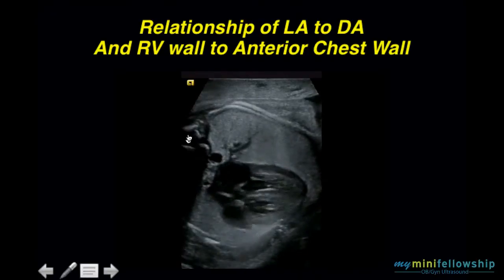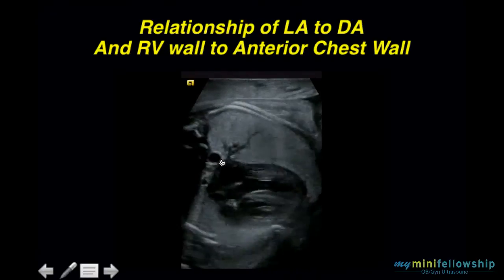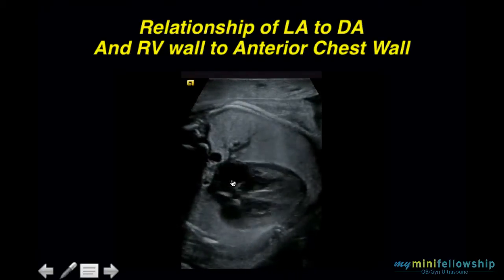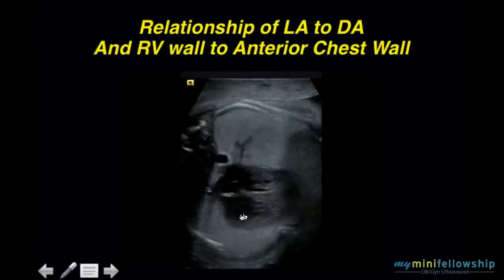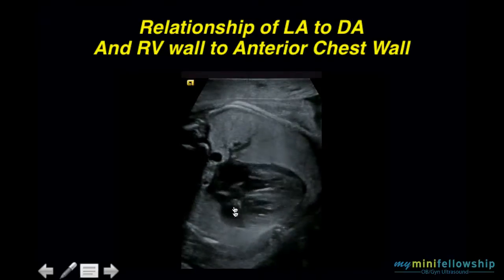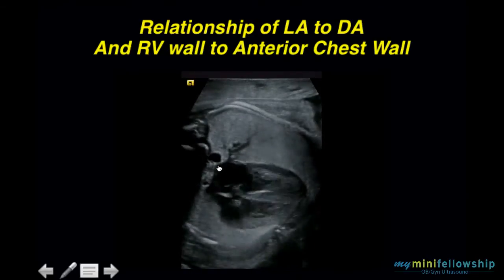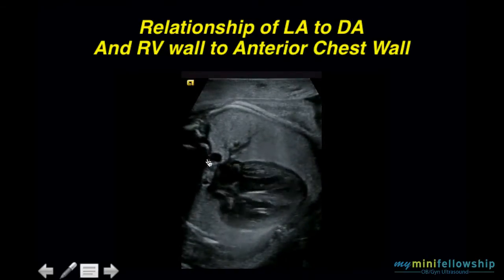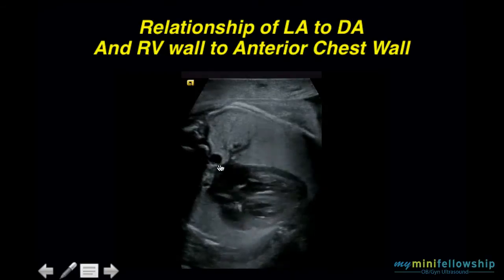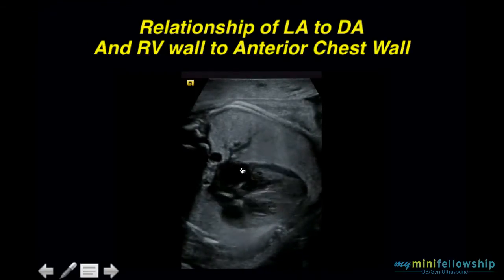Here we have spine, descending aorta, left atrium, left ventricle, right ventricle, right atrium. We identified the left atrium because of its proximity to the descending thoracic aorta.